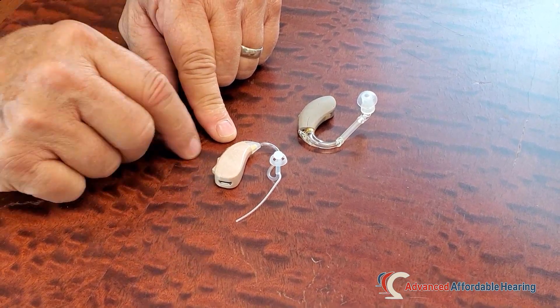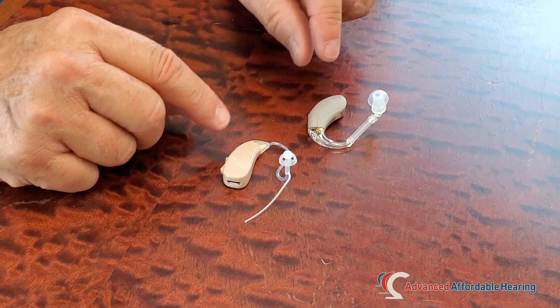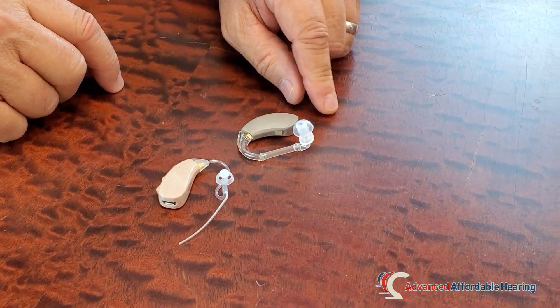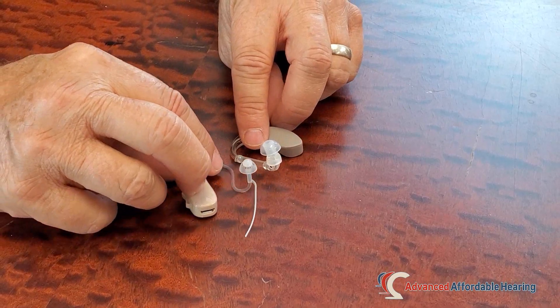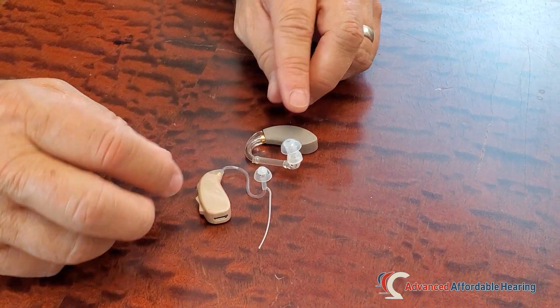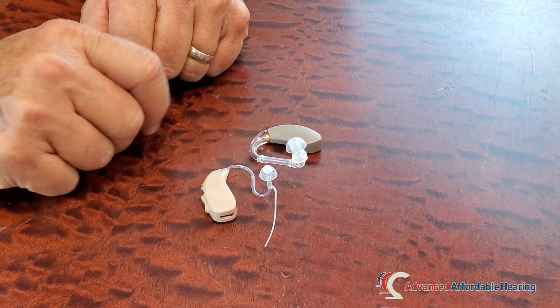However, sometimes it's just not enough volume of sound, and so we offer a power upgrade. As you can see, it is a thicker diameter tube — much thicker. It's akin to pushing water through a garden hose versus a fire hose.